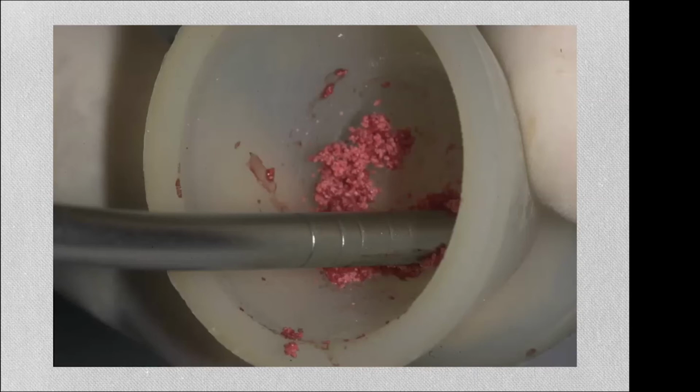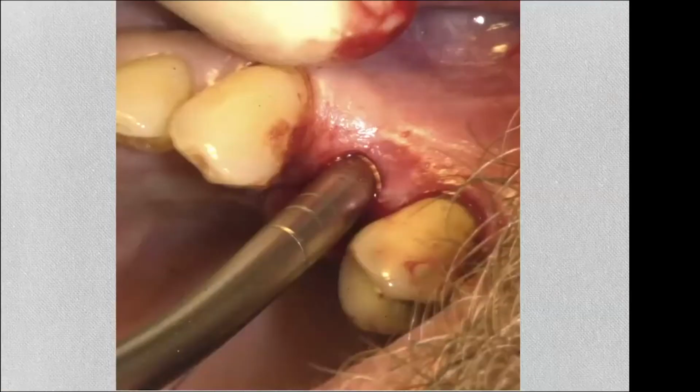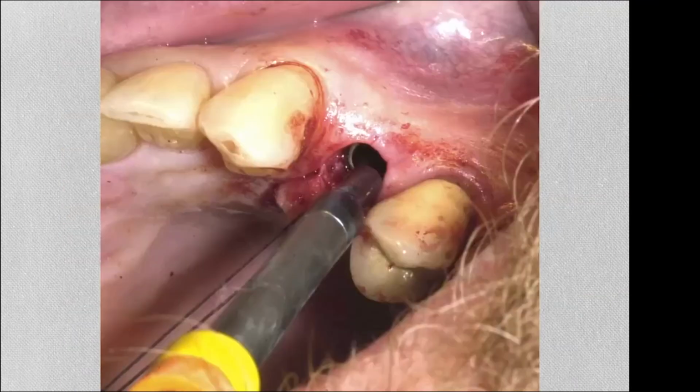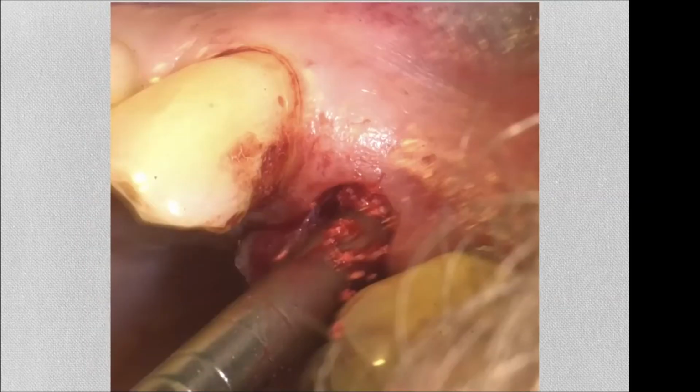Now, in this case, we did not need to do a lot of lifting, just a little bit. So I wasn't relying on the graft particles to finish the job, just wanted them to be there to cover the apex of the implant. And indeed, we introduced the particles lightly, placed the 5x8 short implant, seated it using the seating tip, sealed it, and a little bit more of the graft particles.